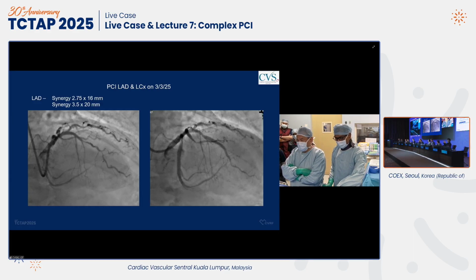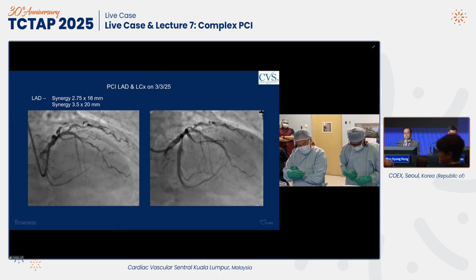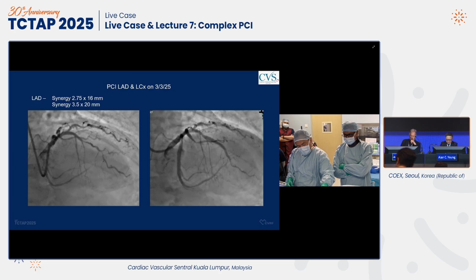We do not have the full angiography pictures for the LAD, but it's very diffuse, and the LIMA would be put very far distal. So he had a bioadaptor implantation in the mid LAD with a drug-eluting balloon distally. And I think, like you say, bypass grafting surgery would involve really distal vessels in the RCA and LAD. It might not be the best thing, I thought, for this patient. The good news is that with PCI, you have not taken away the option for surgery later for whatever reason, because the area that they would bypass, you're not touching anyway.